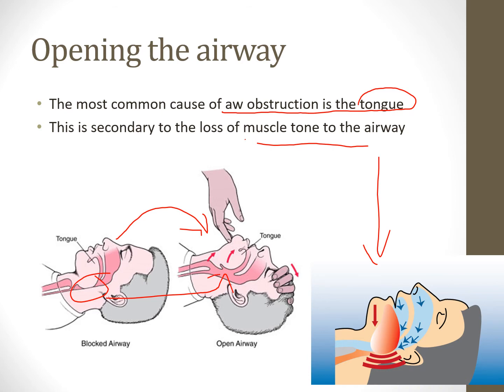And if this patient still has spontaneous breathing, which a lot of patients you will see will still have some spontaneous breathing, right? If we haven't pushed paralytics or anything, that's going to help that patient ultimately ventilate, pre-oxygenate, and pre-ventilate before we intubate. So that's going to be a big bonus.